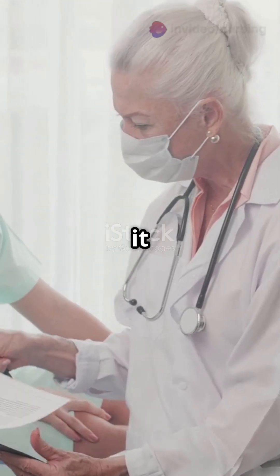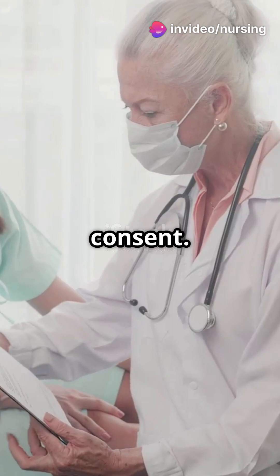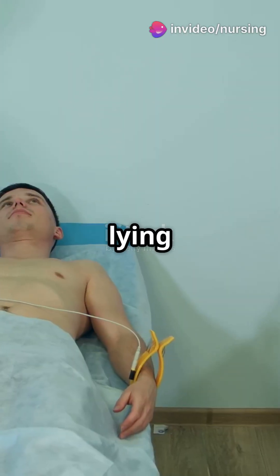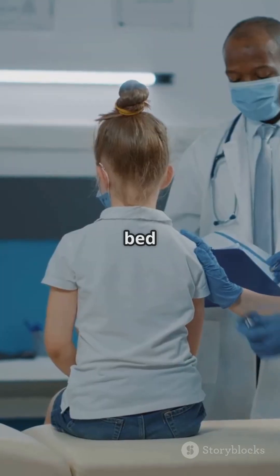Before the procedure, explain it to the patient and get informed consent. Position them upright, leaning over a table, or if they can't sit up, lying on their unaffected side with the head of the bed elevated.